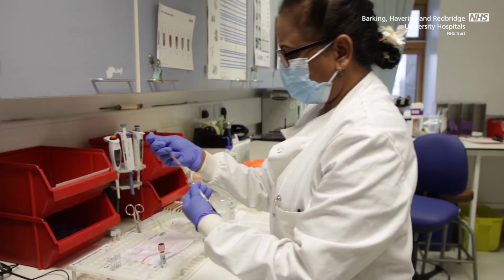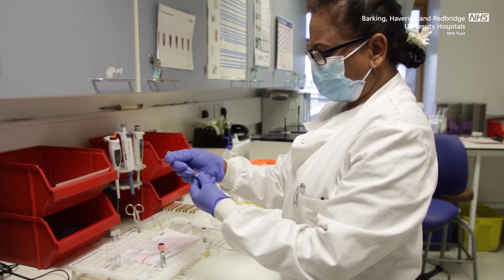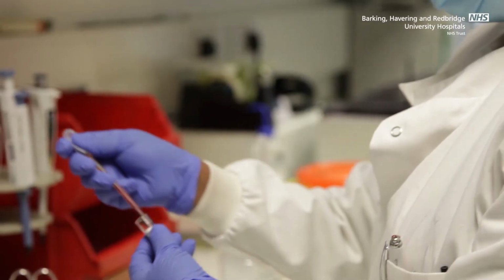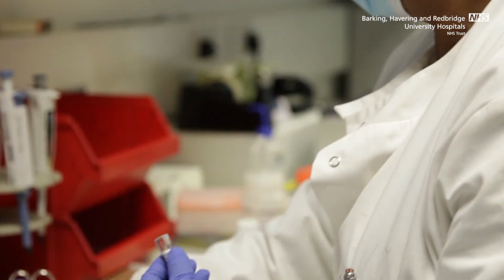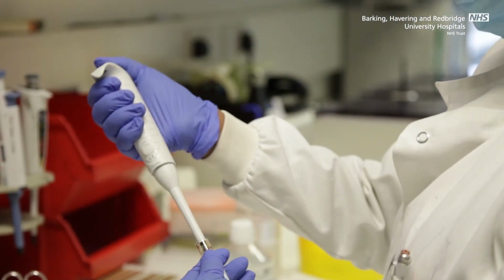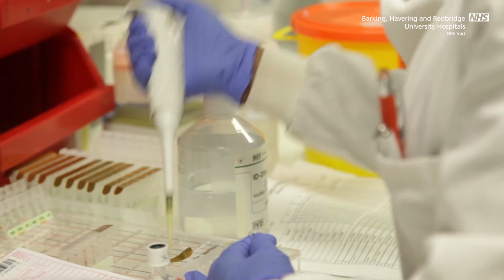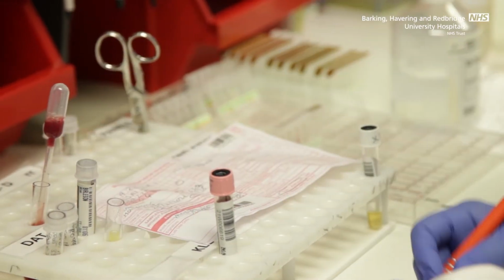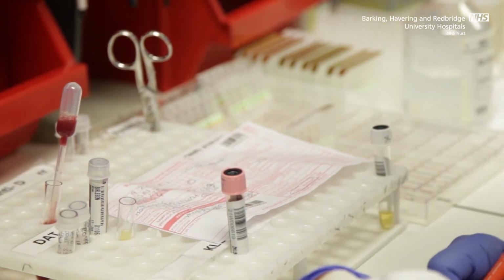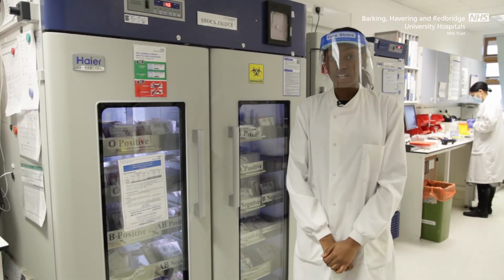The miscellaneous section is where we do manual testing and further grouping investigations. Testing includes all phenotyping, direct antiglobulin test, and also the Kleihauer-Betke test, which tests for fetal maternal hemorrhage in rhesus-negative mothers. In some instances, samples have to be sent to NHS-BT for ABO and rhesus anomalies, antibody titrations, and antibody quantitations. The cross-match section is where the final issue of products happens.